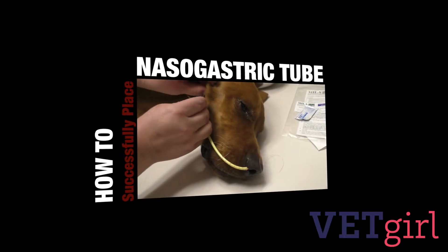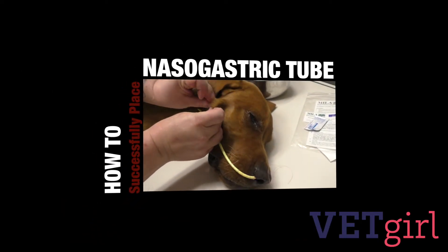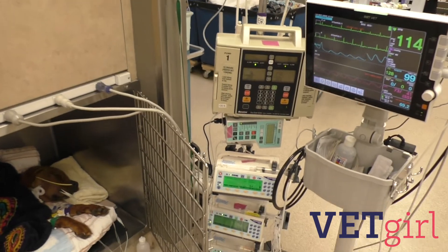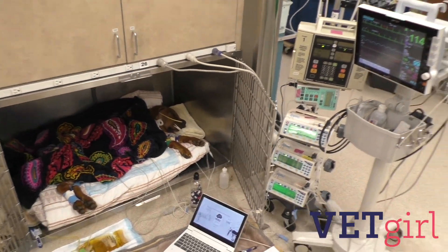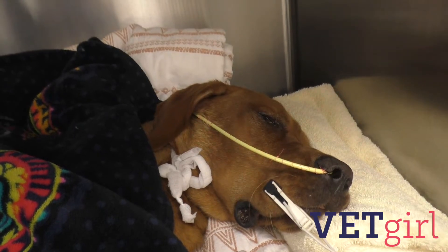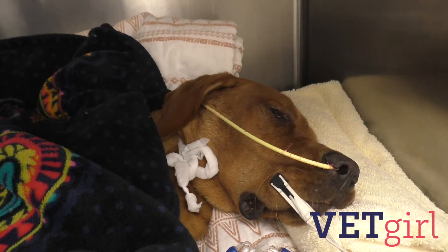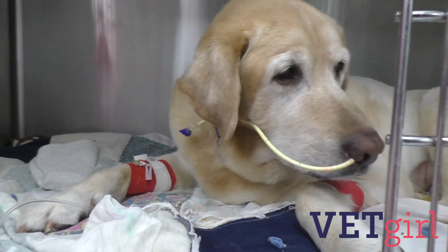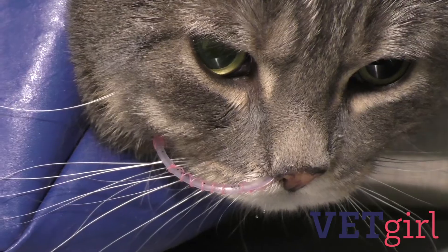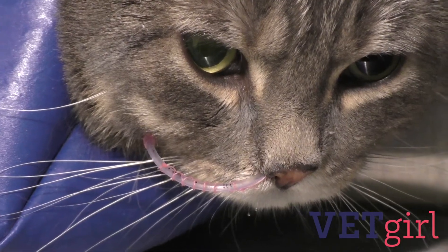In this Vet Girl video, we review how to place a nasogastric feeding tube in your veterinary patient. Nasogastric, NG, or nasoesophageal NE tubes can be a valuable tool to evaluate in your practice. Although feeding tubes may seem intimidating to place, if you follow some simple guidelines, you can successfully and easily place them in general, emergency, or specialty practice.